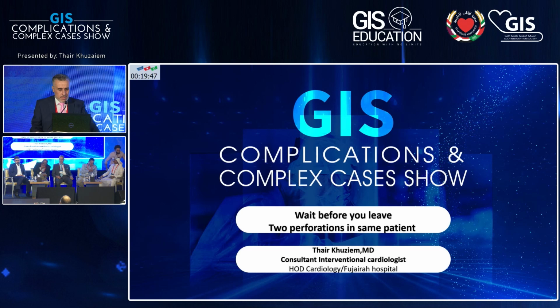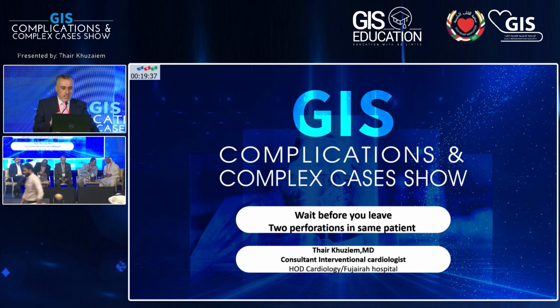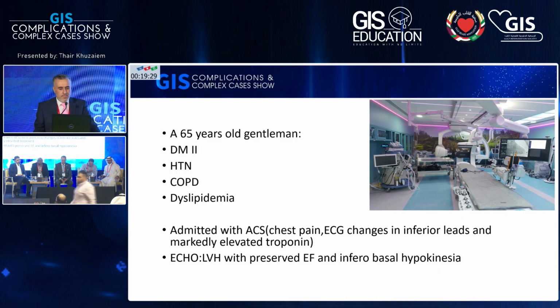So my case, probably a simple case after all these complex cases, is two perforations in the same patient. But what I want to say is that when you do a CHIPS case or a highly complex case, please just wait. Don't declare victory before you are sure that there is no complication. And this is the idea of our presentation today.